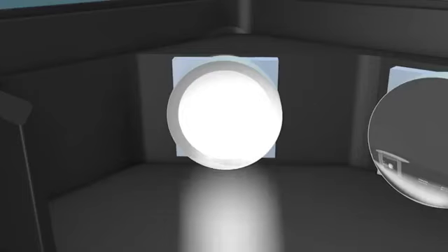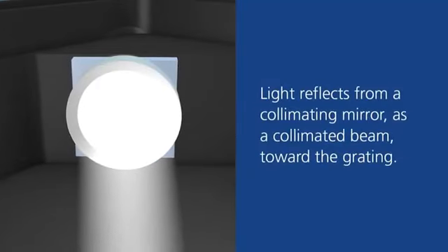The automatic biochemical analyzer has automated the sequence of operation processes which used to be conducted by hand and evaluated by eye or using a spectrophotometer. In the past, the samples for analysis are the pale yellow liquid portion of blood called blood serum and urine. A certain precise volume of sample, normally 30 microliters, is collected by using a dilution pipette and diluted by 5 times using a dilution disc. The measurable sample is 150 microliters.